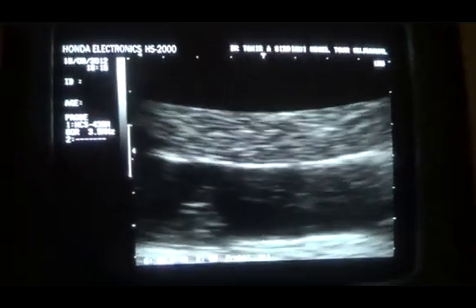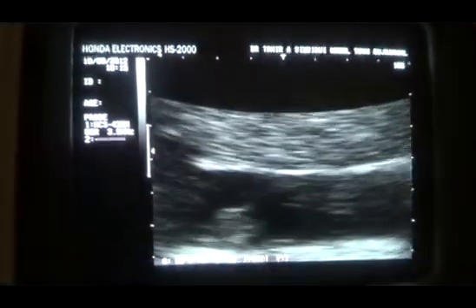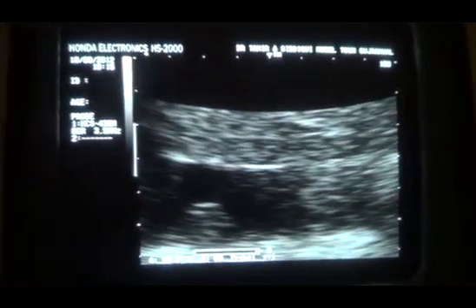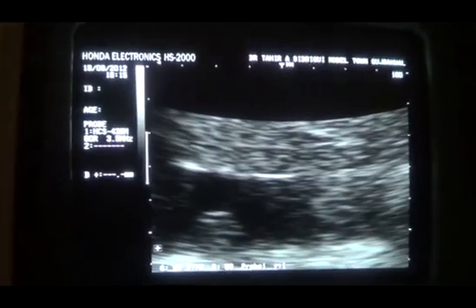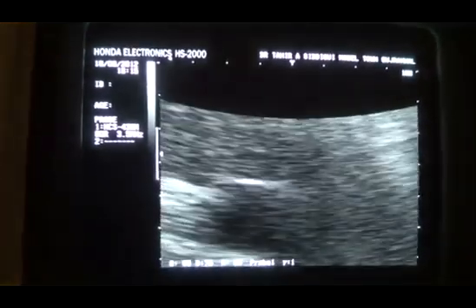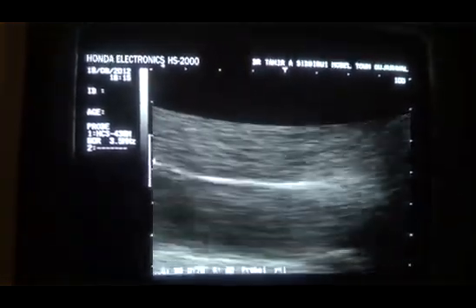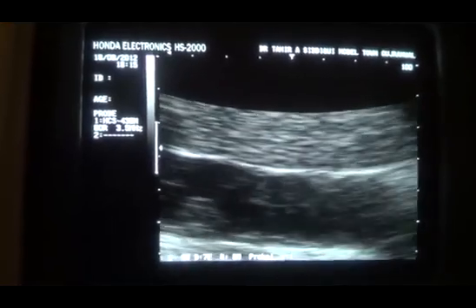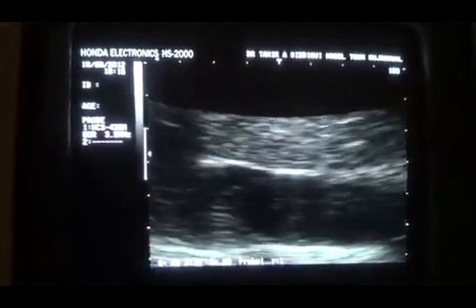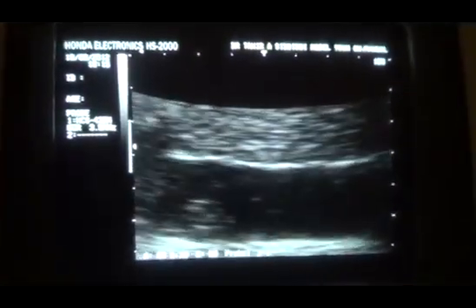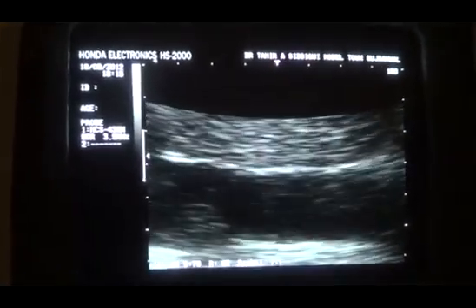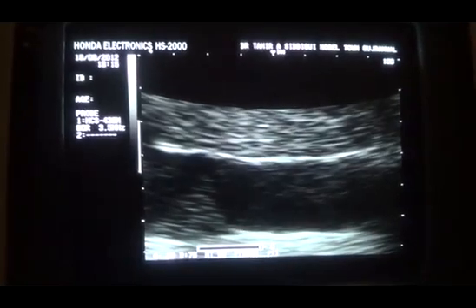You can see that the clot is there. This is the lumen of the inferior vena cava. This is the clot. Remember the shape of the clot — it persists in the same location. This is a short study regarding the clot in the inferior vena cava. Thank you.